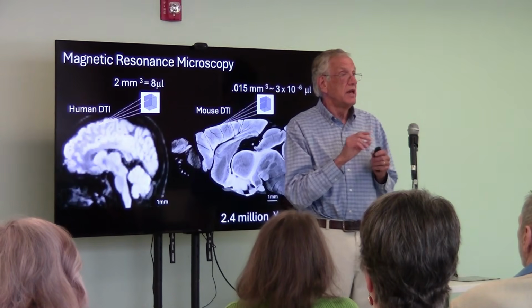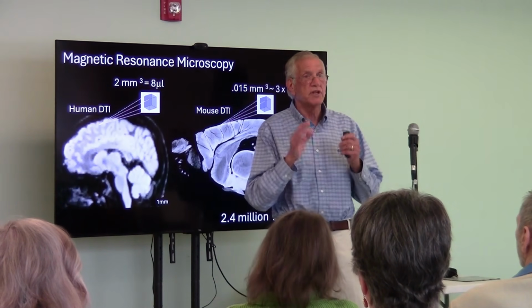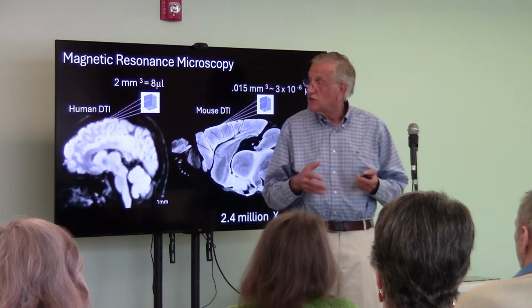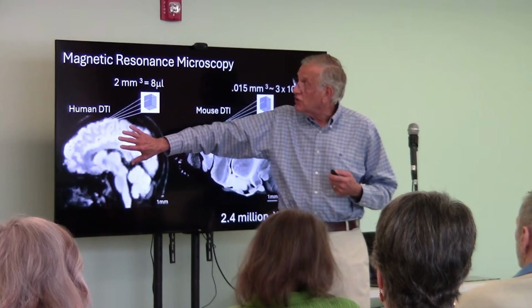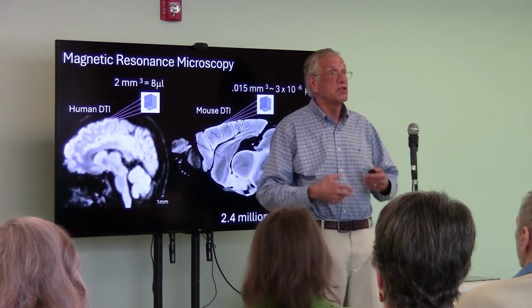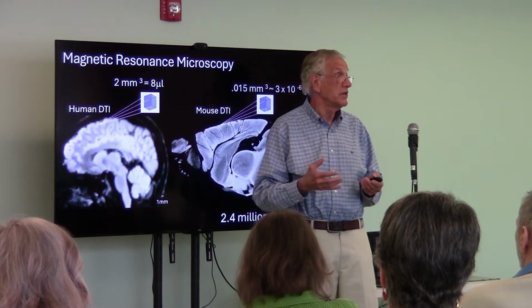So here is my brain imaged about 8 or 10 years ago using this diffusion technique. Now this is a pretty crappy image because to do diffusion imaging you have to take a whole bunch of images and then do some math. So they give up on spatial resolution because you get more contrast resolution. So these are voxels that are on the order of 2 by 2 by 2. That's 8 times bigger than what you'll get if you go in for an MR scan today.